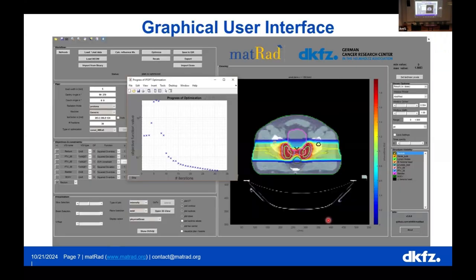As said, this is how it looks, and we will see this in detail later after the coffee break.